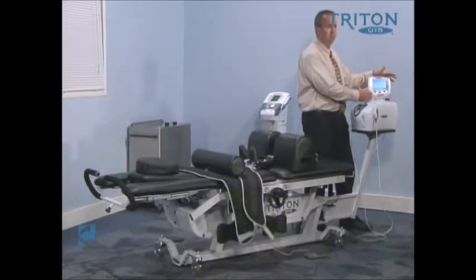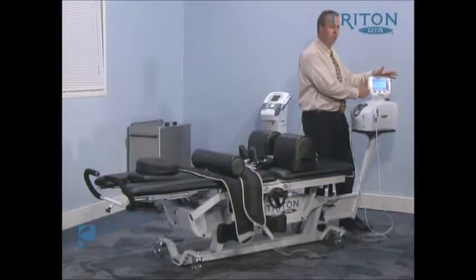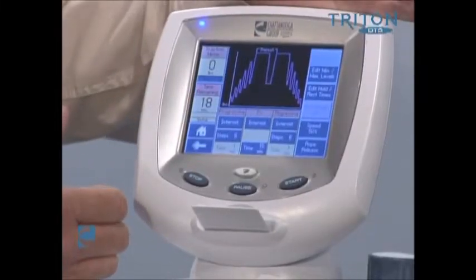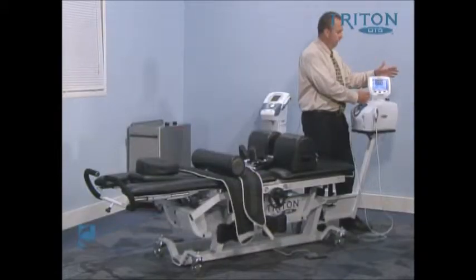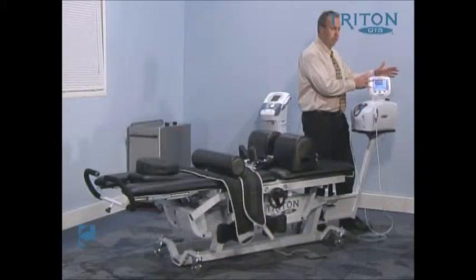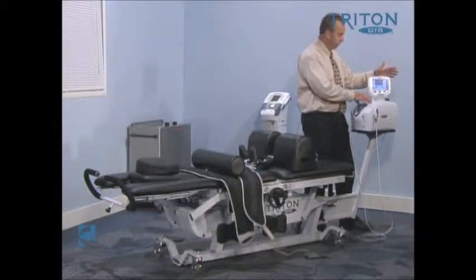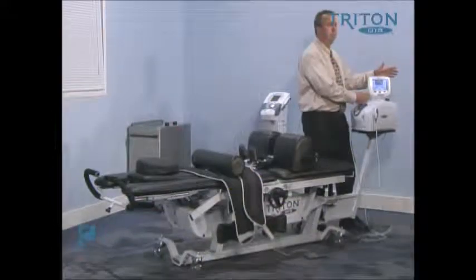It will then bring us to a screen that gives us an opportunity to look at what the parameter settings are. If you feel it doesn't necessarily fit your patient presentation and you wanted to change something, you can do so by simply hitting the edit button. To me, this is the largest benefit of this new DTS technology — our ability to manipulate all these parameters.